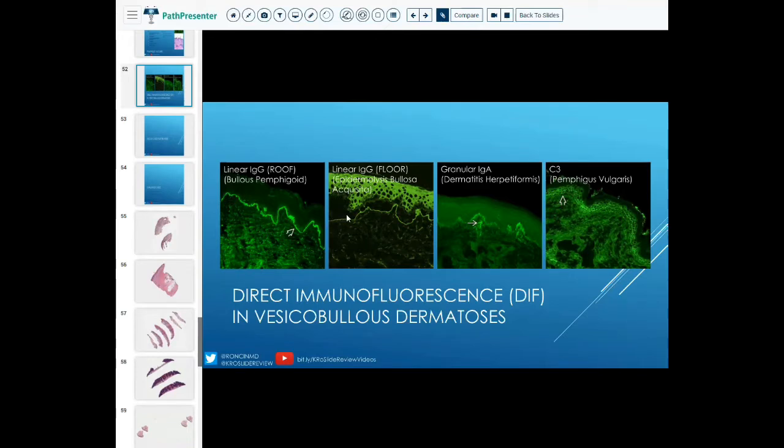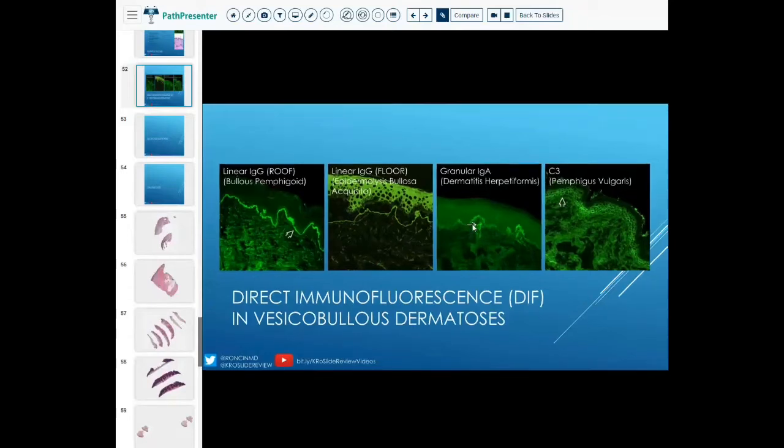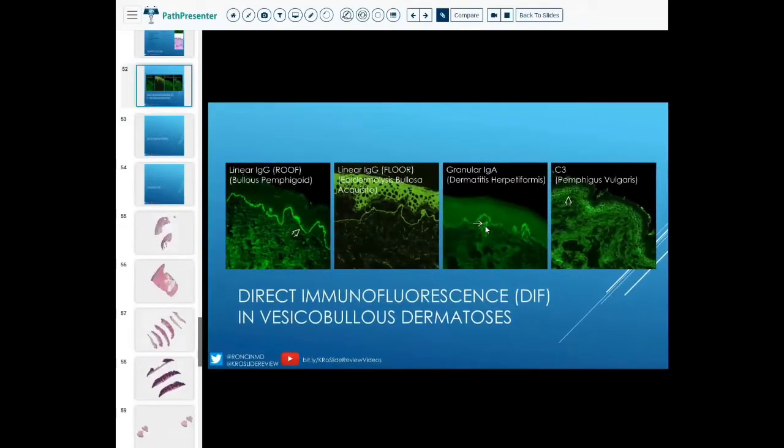Within these areas where you can imagine that there would be a neutrophilic infiltrate with this clefting above, that's where you would have your IgA, and the chicken wire appearance for pemphigus vulgaris. So again, an IgG would do the same thing. So you can see either both IgG and C3 or either of them. And this would be your tombstoning area. Okay, so your basal keratinocytes retain their attachment to the dermis, and then there's that lift off of the epidermal cells.